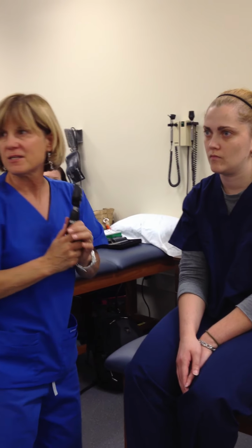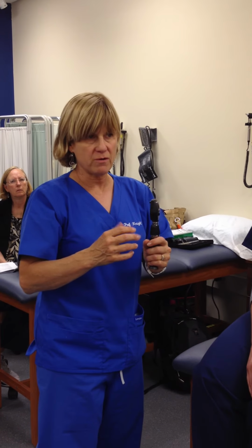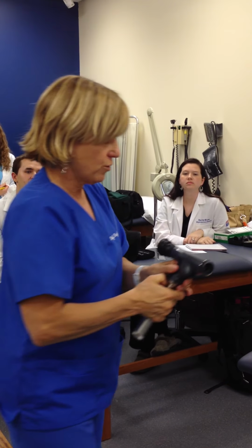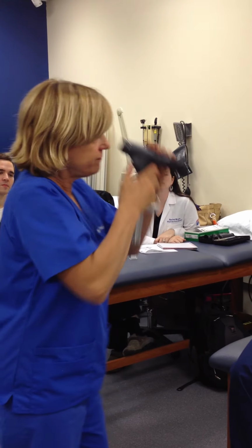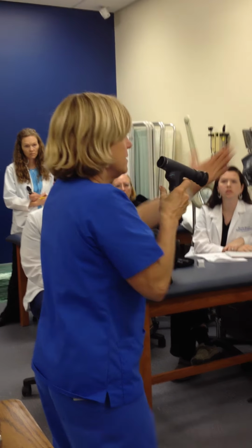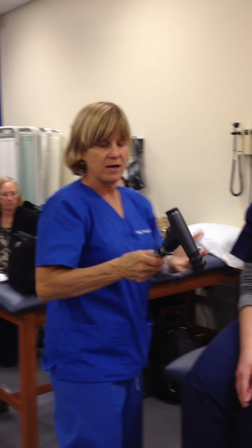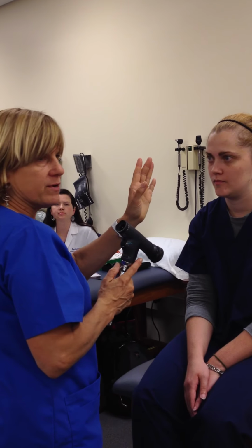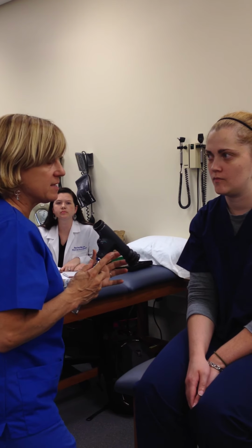The panoptics are a whole different story, and does anybody have their pen? Thank you. Panoptic again, we're going to turn it on, we're going to focus. You don't have to focus on her, you can focus out here, focus a little bit on something in front of you, and now you're ready, okay? And now we're going to drive a little straighter in on these. At least that's what most of the students have been saying, that it helps.